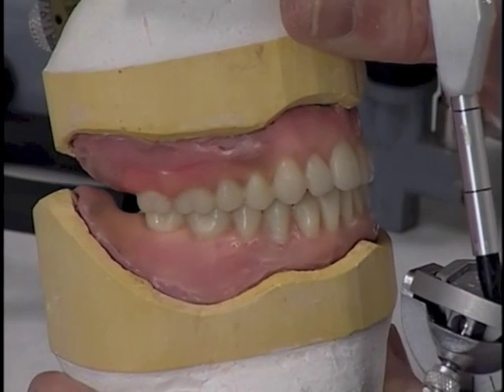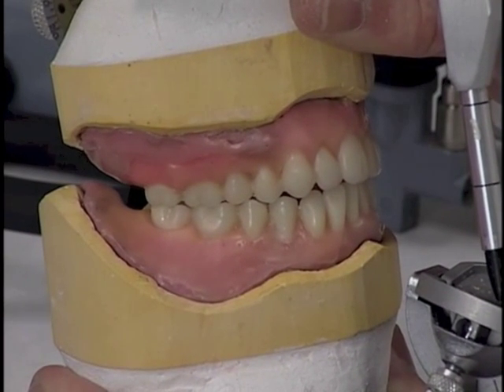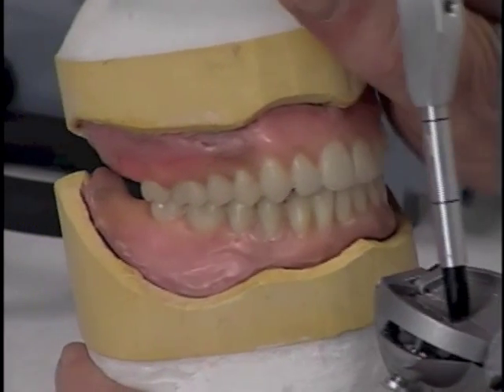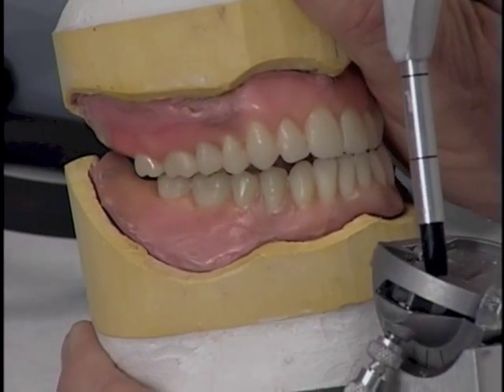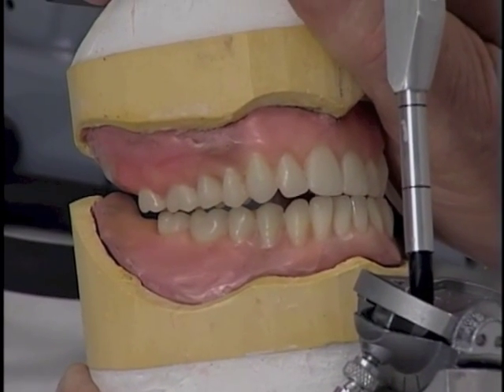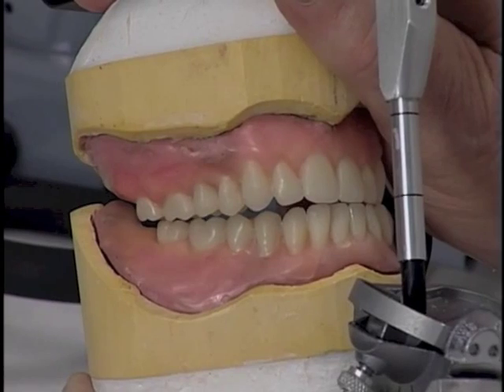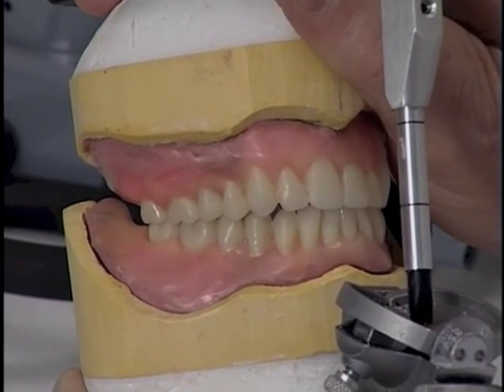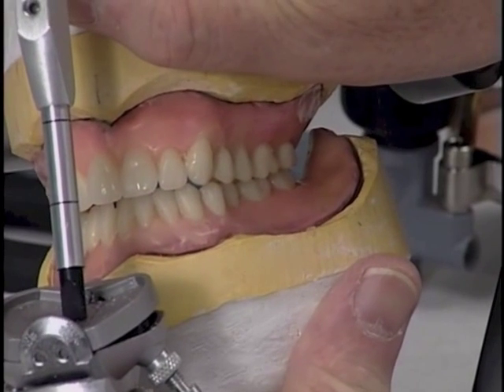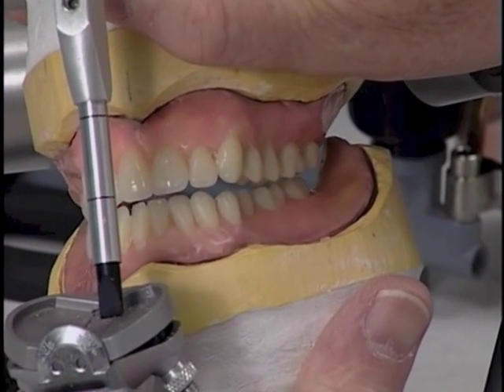And when we place it into working relation, we have good contacts of all of those slopes. We also can, when we go into working relation on the opposite side, observe that we have lingual contacts of all of the maxillary posterior lingual cusps with the mandibular buccal cusps. And the same is true on the other side.